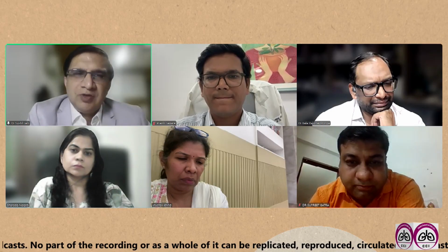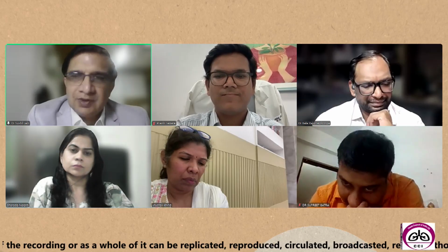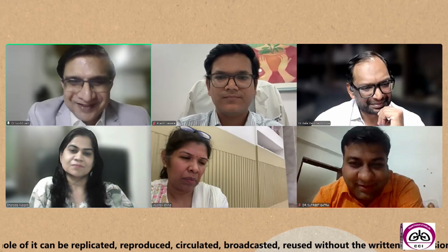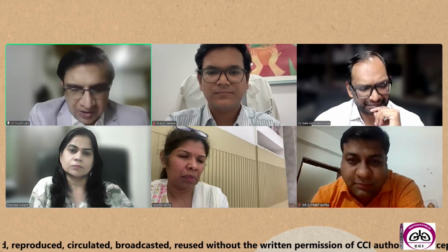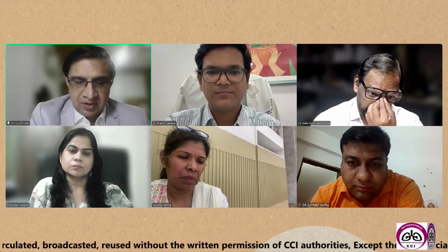I think that most of the time the bleeding is very minimal and we don't need to do anything about it. And if some major bleeding like what you have mentioned happens, then you cannot do much about it. You have to call a surgeon or the critical care team for help. So I think for EBUS, if there is bleeding, you don't worry about it. Usually it settles on its own. That's the message we want to convey to the audience.